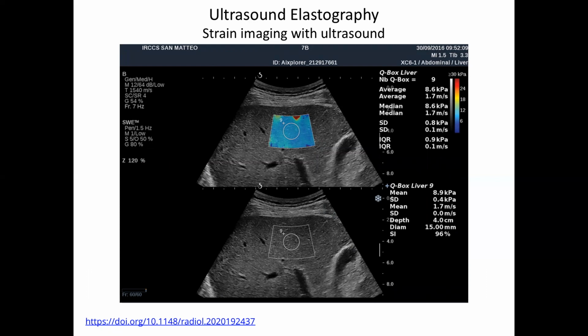Just saying, how stiff is your liver? Is it in the normal range? If you could do it just like this, it was great. The issue is that they're still in the phase of this technology where there's a lot of variability in the numbers that are coming out. This entire article is about establishing what variability is reasonable for making this measurement.